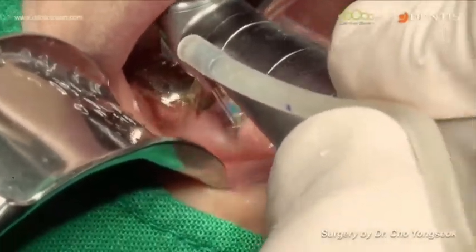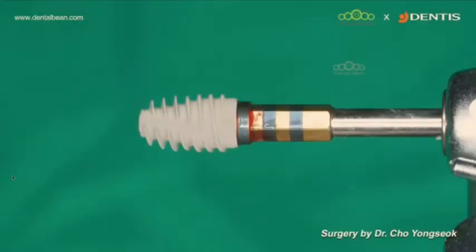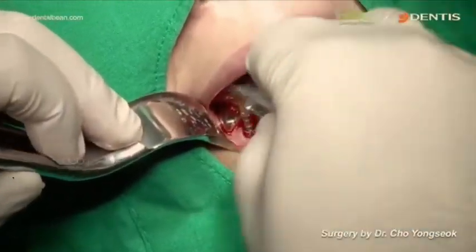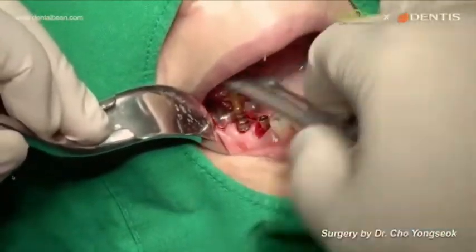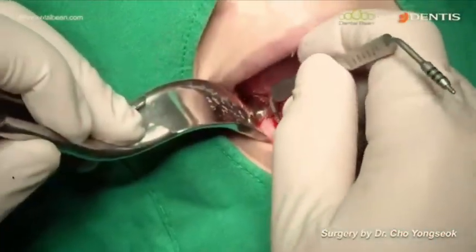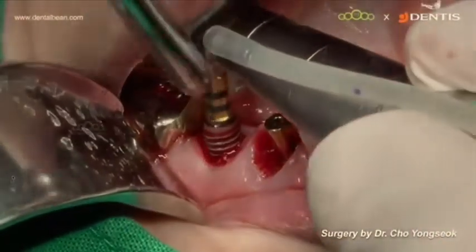4.5 set drill and last drill 5 millimeter. One step oversized drill was used. Still, the implant was very strong. Insertion torque was high. So I decided to prep additionally. I used the last drill and slightly shook the drill to increase the osteotomy site.